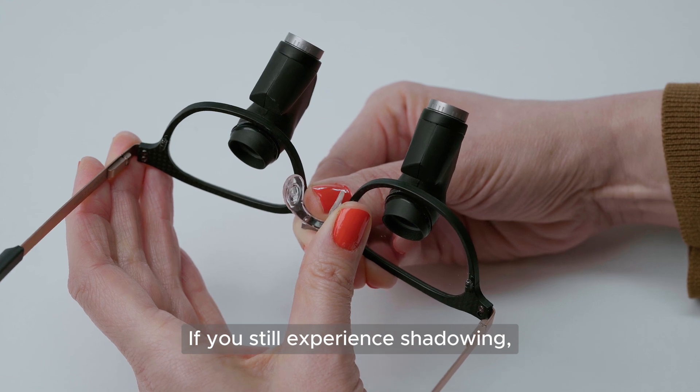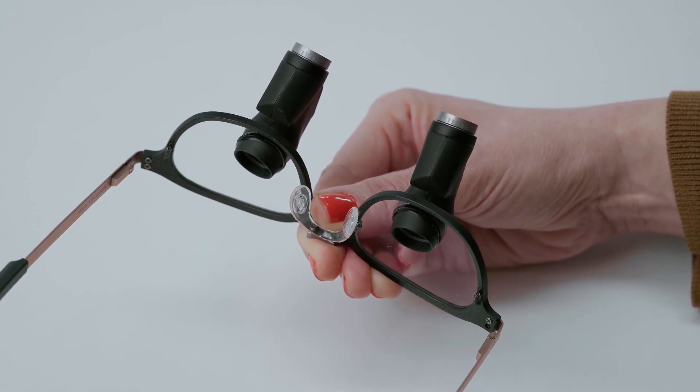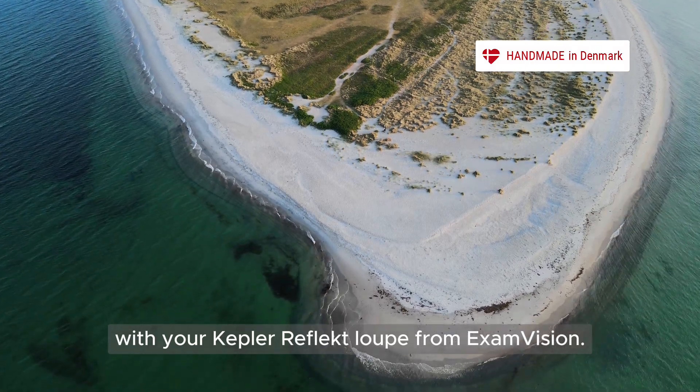If you still experience shadowing, contact your ExamVision dealer for assistance. Enjoy working in a new, ergonomic position with your Kepler Reflekt loupe from ExamVision.